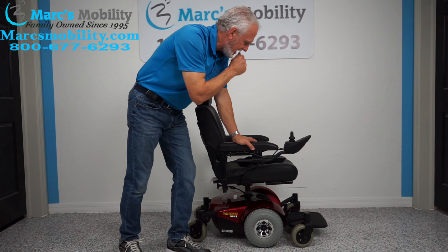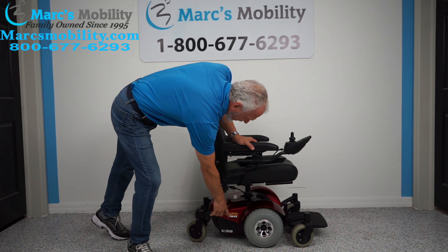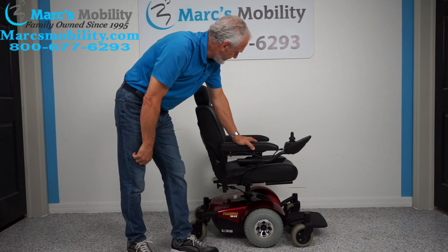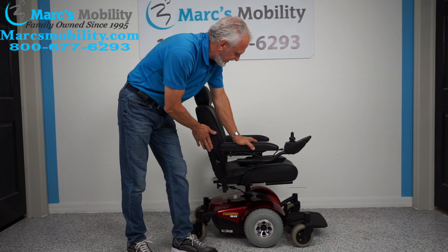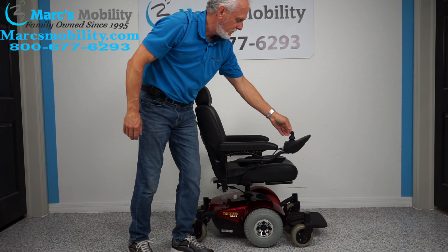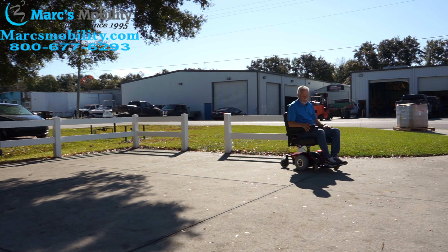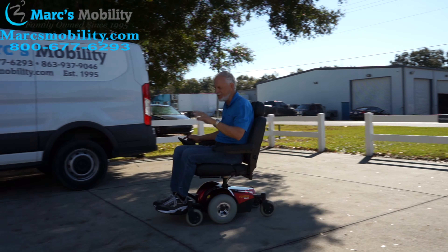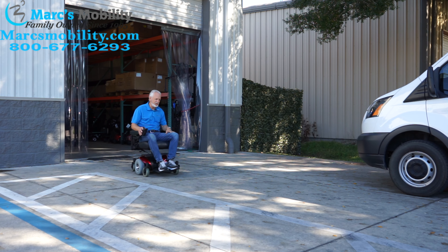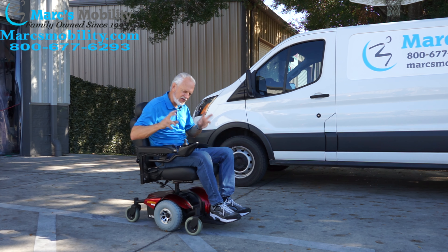Let's recap. This is an Invacare Pronto M — M for mid-wheel drive — 41. Solid tires, top speed about five miles an hour. This is kind of a quick chair. Arms do flip up. The seat is a captain seat, 19 by 19. Just a very compact small power chair. Top speed five miles an hour — pretty fast for a small chair, maybe even a little faster. It has an electromagnetic brake in the motor, so when you let go the chair stops.